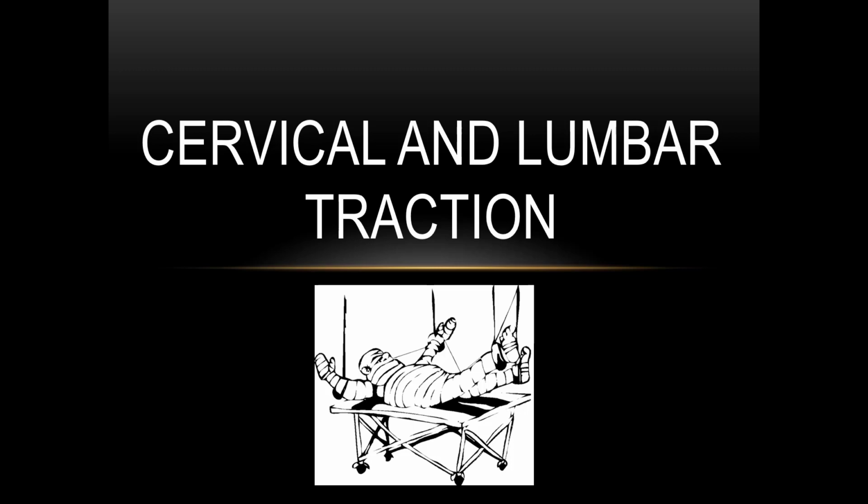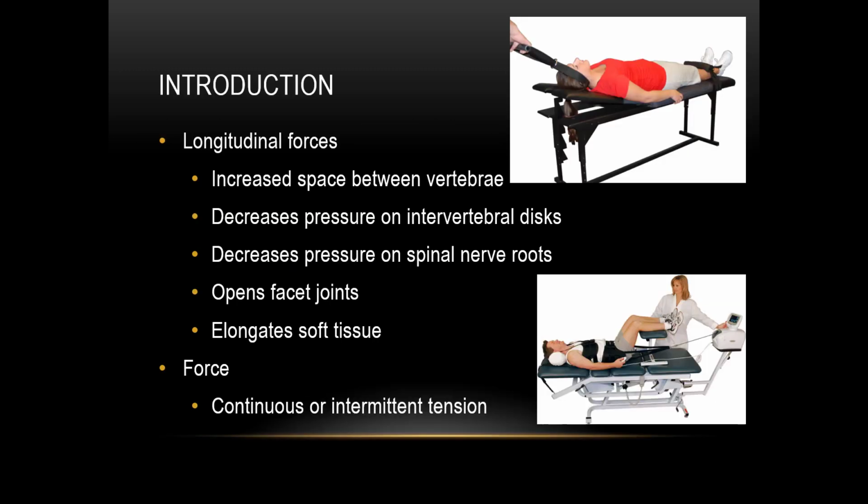Cervical and lumbar traction. Traction is a technique that applies a longitudinal force to the spine and associated structures, thus distracting the vertebrae. The distractive forces can be administered by gravity, a machine, a clinician, or by the position of the patient's body.